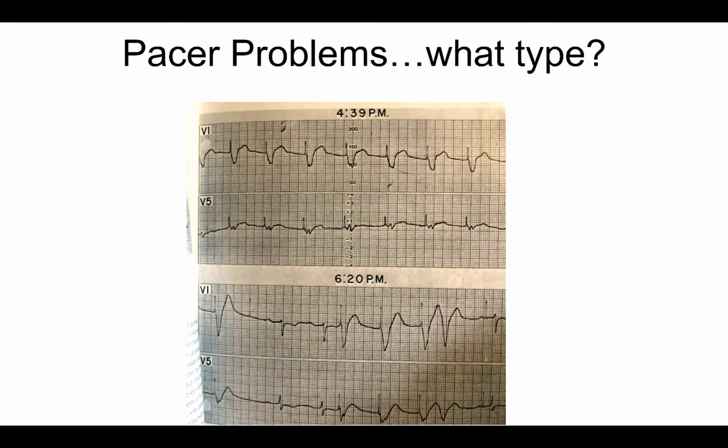And normally when we're programming a permanent pacemaker, Mohammed, how high do we set the output relative to the threshold? If the threshold, for example, is 1 volt, how would you set the output on a permanent internal pacemaker that's been in for a long time?